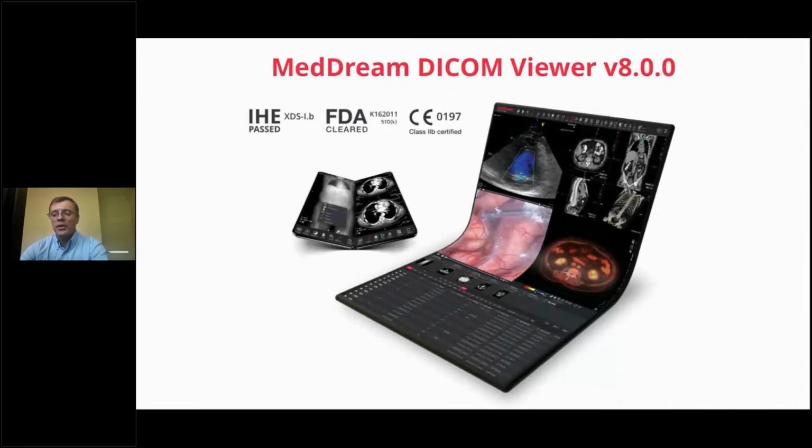And I believe the 8th version will be the most changeable version of all time for Softneta, because the challenges stay the same for version 8. We are planning to continuously improve the speed, but along with the speed our plans also include mammography. As you know, we are already in the final process of FDA approval for mammo.